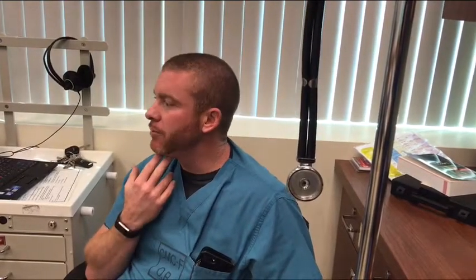Oh, that would be important. Would you be able to change the vent setting to SIMV? Good. This one has a little lower rate. Yes, absolutely. Not every place has it. I refrain. I've done this before. I think it's too many details for you guys at this point. I'd rather just learn the basics. But you absolutely can.